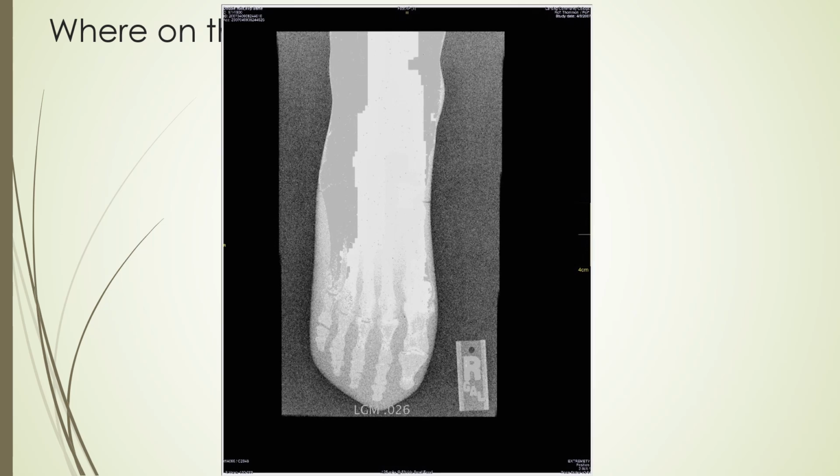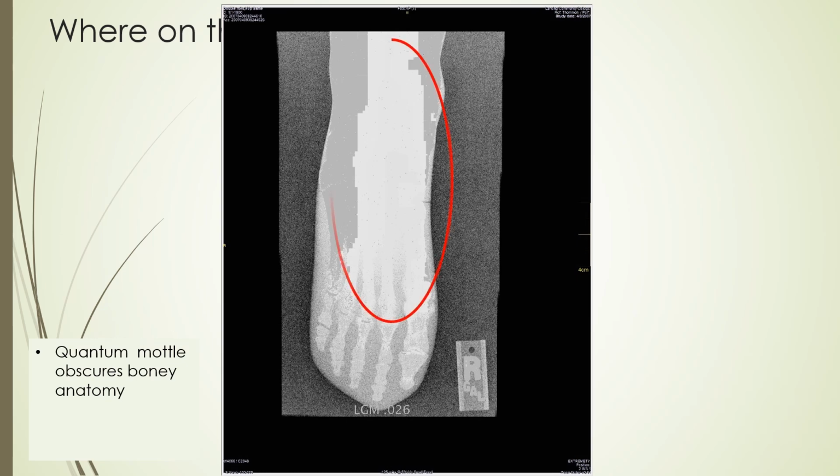First, the underexposed image. The radiation density in the tarsal metatarsal area is so low that the computer was unable to reconstruct the data. The image appears underpenetrated, but this is not the case. There is too little radiation coverage and the computer cannot reconstruct the image. It cannot separate image from noise. The only salvation for this image is to repeat it using more mAs.